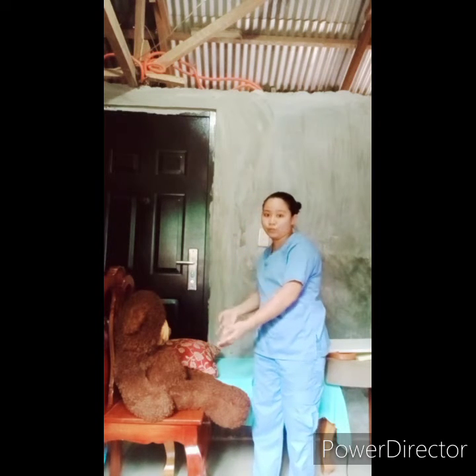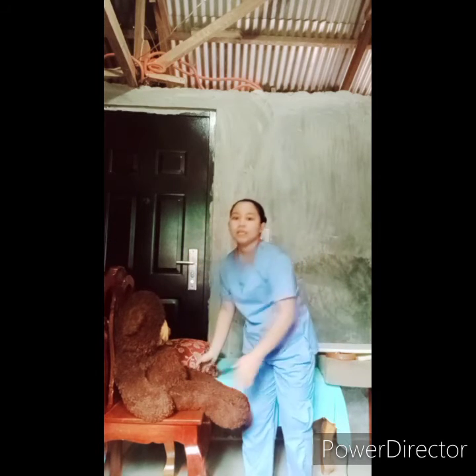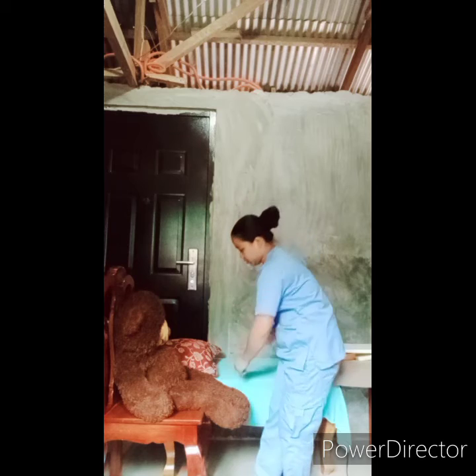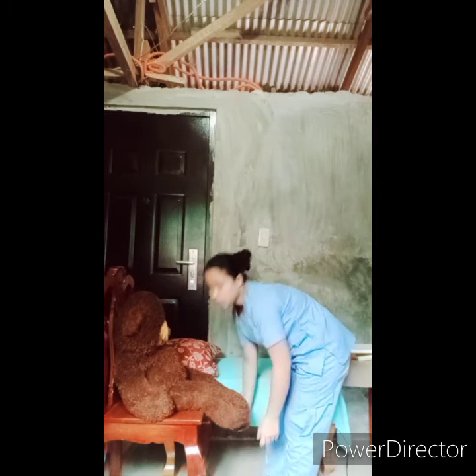Next, let's transfer the patient from a wheelchair to the bed if the patient is non-weight bearing but cooperative, using a transfer board. This is the transfer board. First, let's position the wheelchair properly next to the bed. Next, let's remove the armrest nearest to the bed. Next, let's lock the wheelchair. Then next, let's raise the foot plates. And then next, let's place the transfer belt on the patient appropriately. This is the transfer belt.